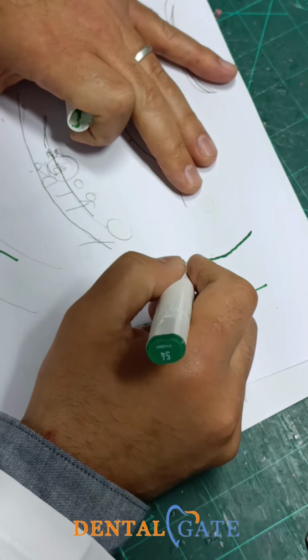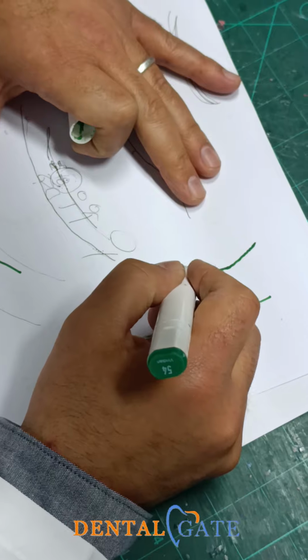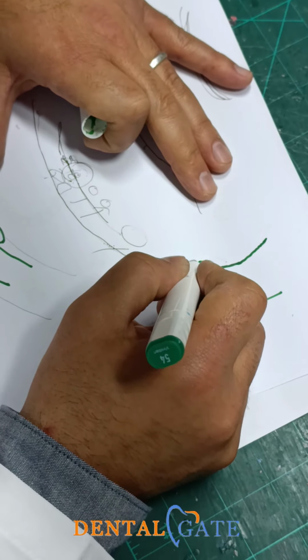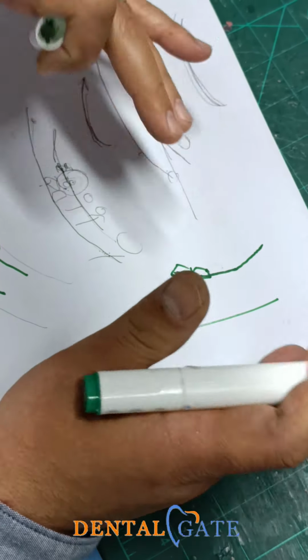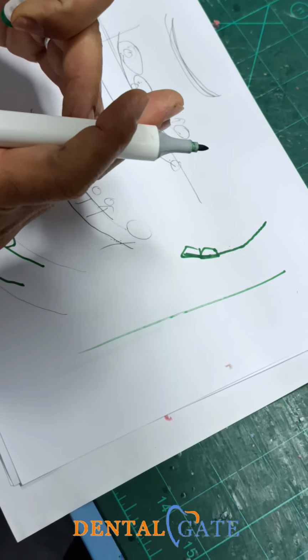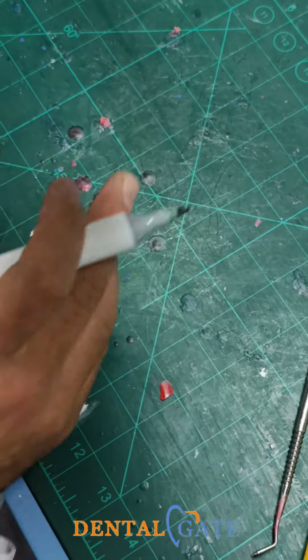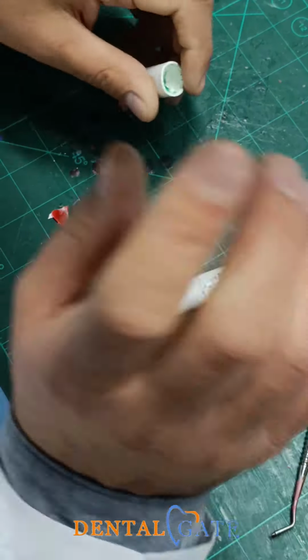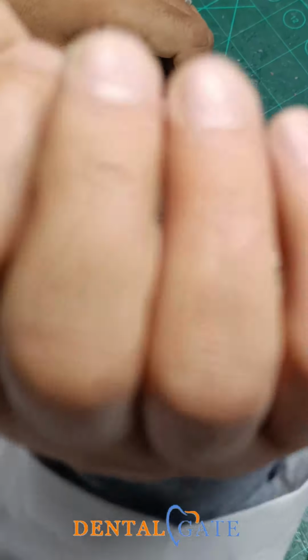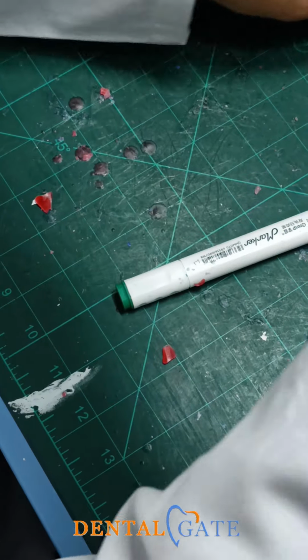I have a curve here. The upper 6 should be located here. The upper 7, the upper molar, should start to make a final curve here, a horizontal one, I mean, within the tilting, so the lower molars easily contact with the normal occlusion, the grooves within the cusps.